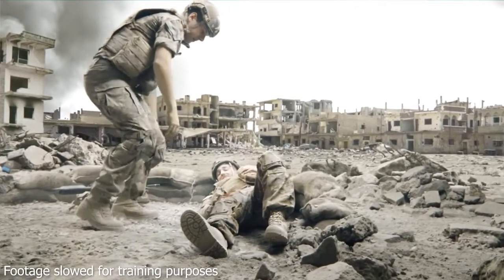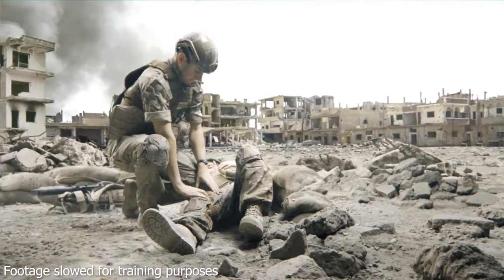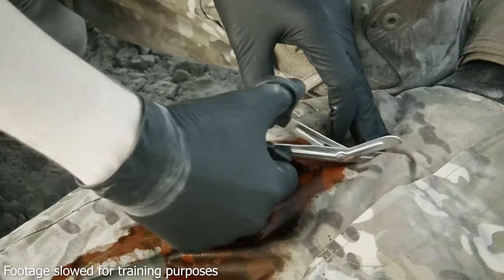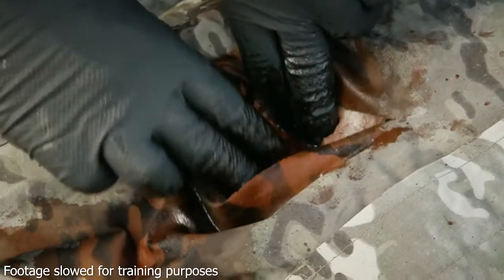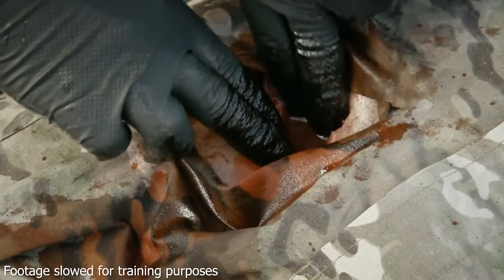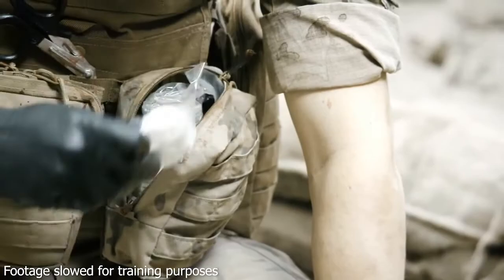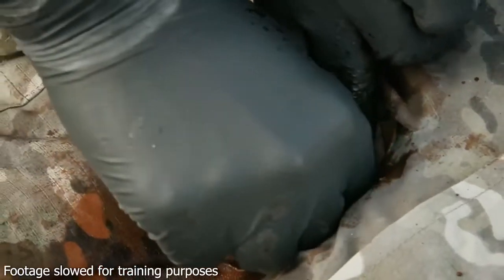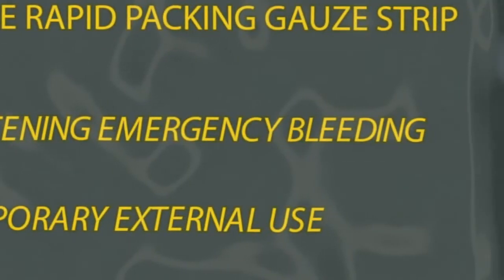When responding to a casualty, it's important to identify catastrophic external hemorrhage as soon as possible. Fully expose the wound, identify the point of bleeding, and apply direct pressure to stem the flow and gain control of bleeding. If blood has pooled in the wound, remove the excess using plain gauze, swabs, or whatever material is available. Celox Gauze is indicated for life-threatening bleeding.